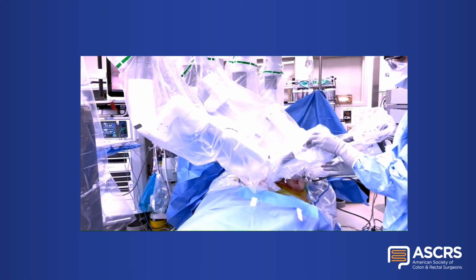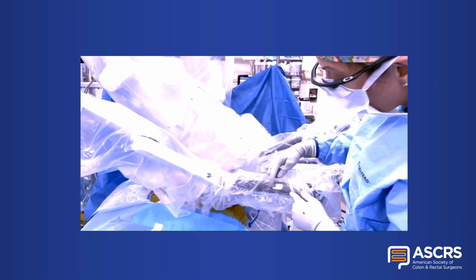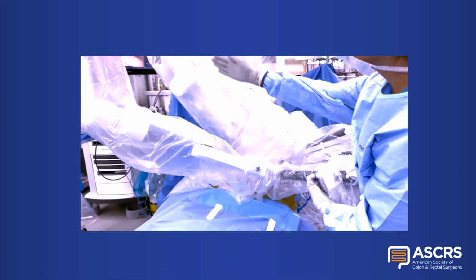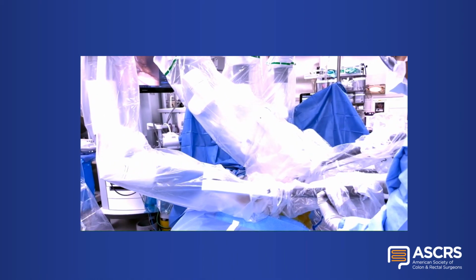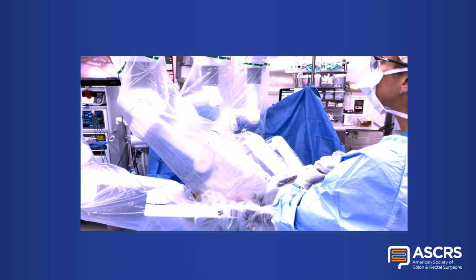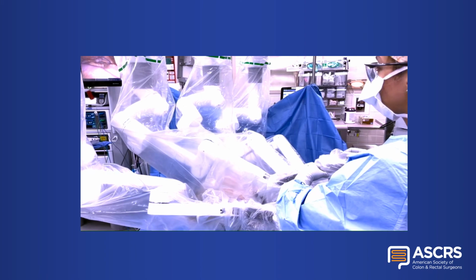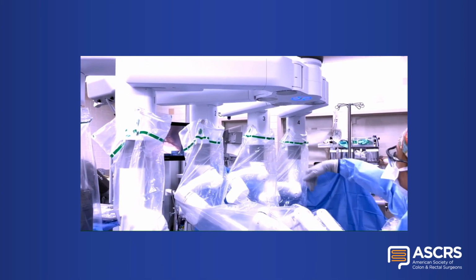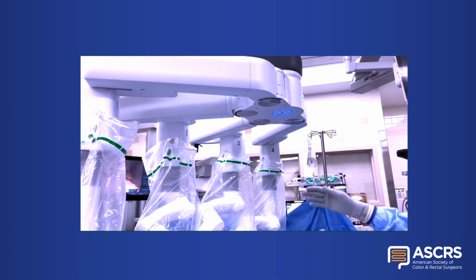We will adjust the patient clearance joint, leaving a fist width of space between the arms and the patient. Flex joints so all the arms are working in parallel toward the target anatomy, and use the patient clearance joint to move the back end of the arms away from each other to avoid collision.